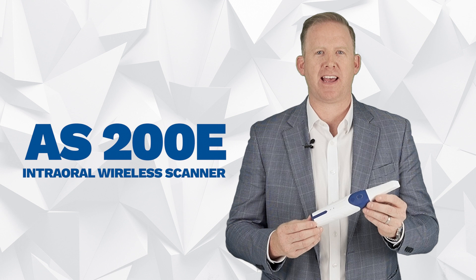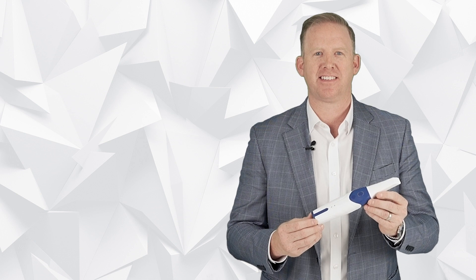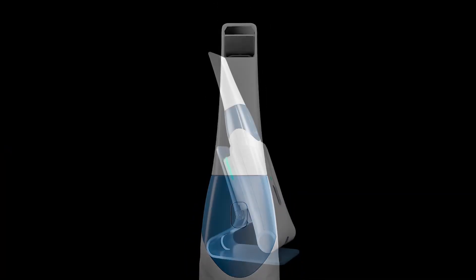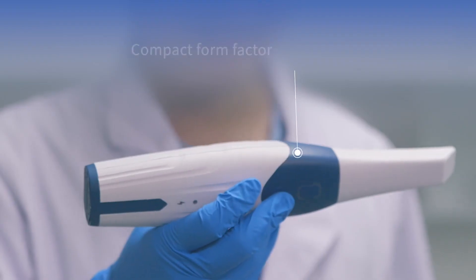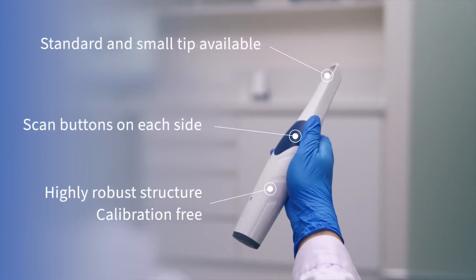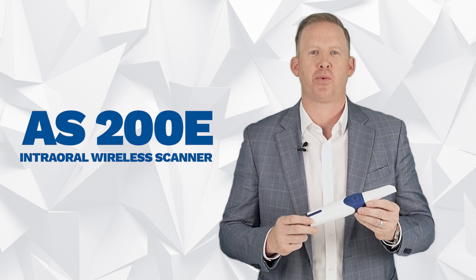Alginate is out and digital impressions are here to stay in pediatric dentistry. I'm Mike Lesberg with NewSmile and can't wait to tell you about our newest product. The intraoral wireless scanner is going to change the way you practice.